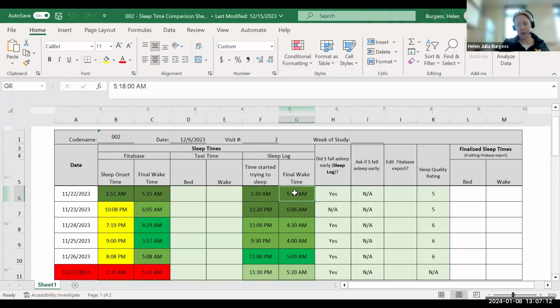This is what we did with the Spectrum. It's what we're doing with the Fitbit. And it really helps when you come to analyzing the data to have had that opportunity to ask the participants some questions. Okay, so we'll start off with what I guess could be a good night, as in everything aligns.